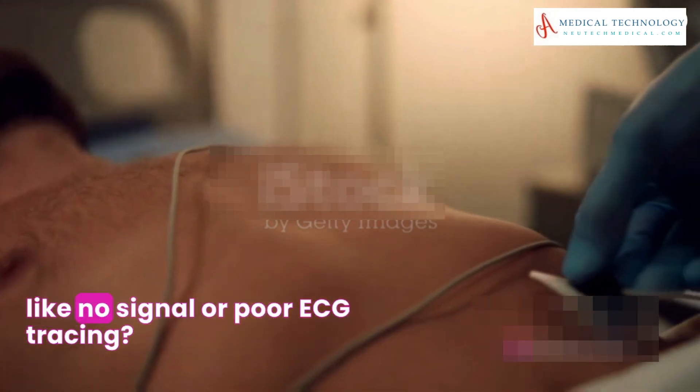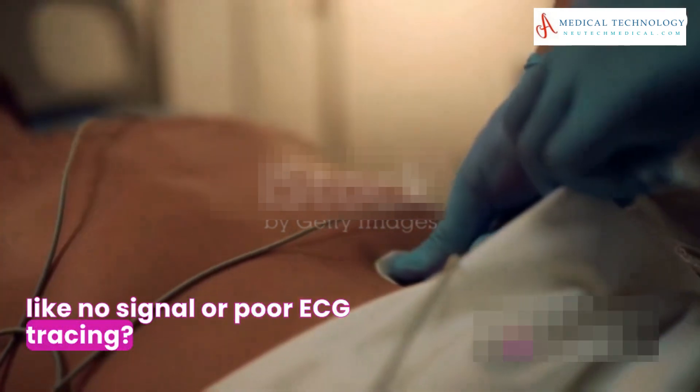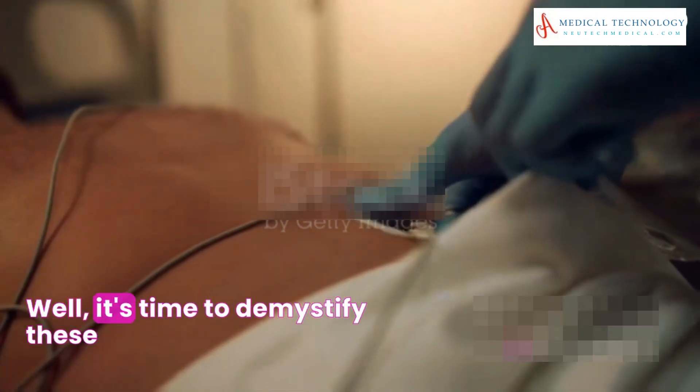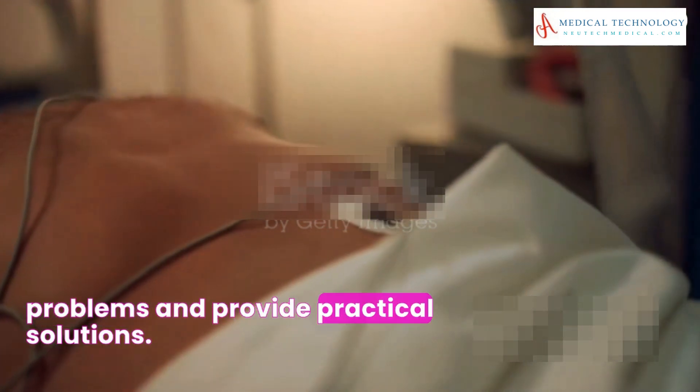Ever wondered why your ECG machine is giving you a headache with common issues like no signal or poor ECG tracing? It's time to demystify these problems and provide practical solutions.